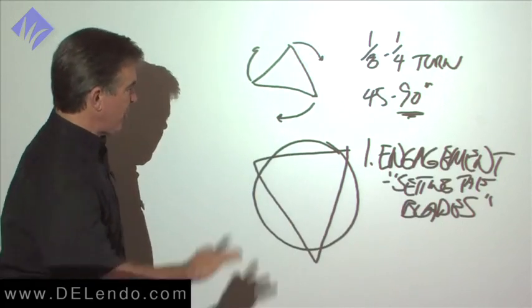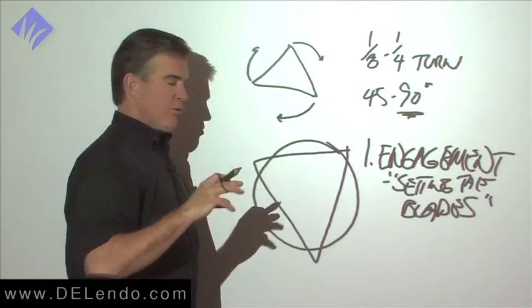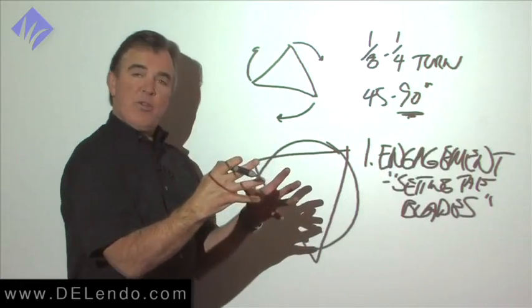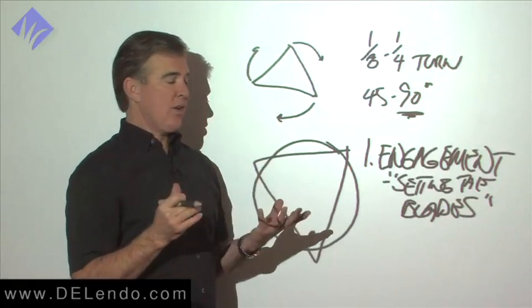Okay, so we've threaded the file. It's a screw thread, a helical thread like a screw, and we've threaded in the canal 45 to 90 degrees. The file has moved into the canal. Okay, and I mentioned this when I talk about using all files.